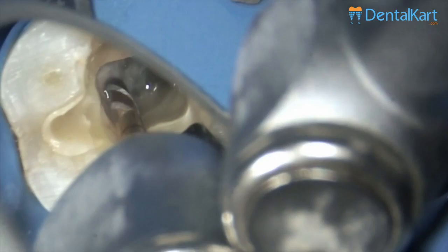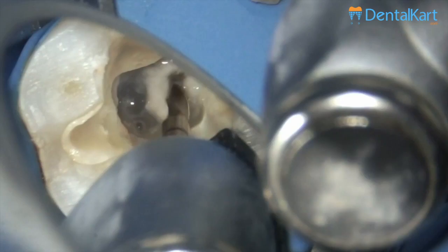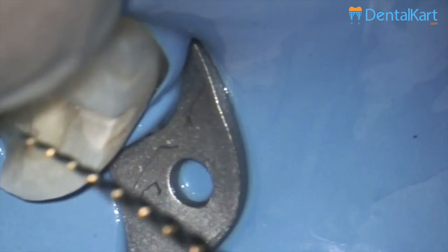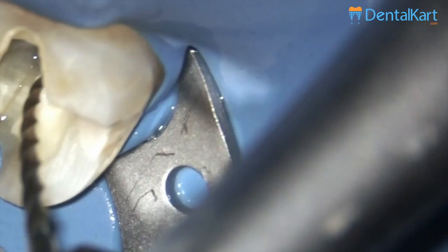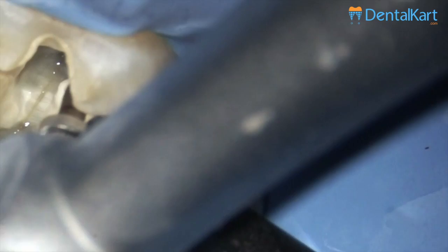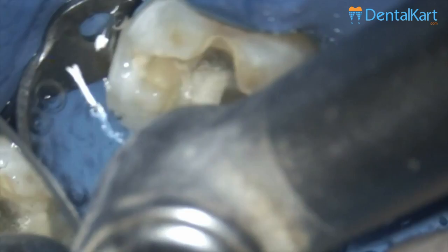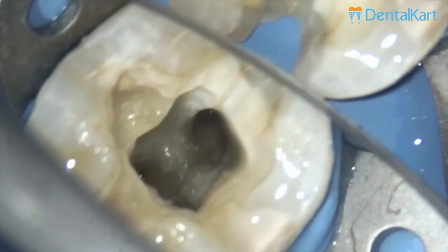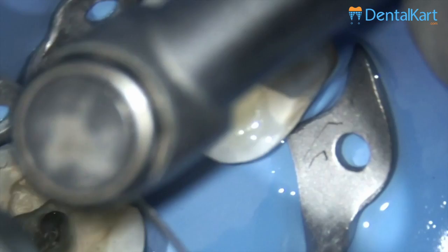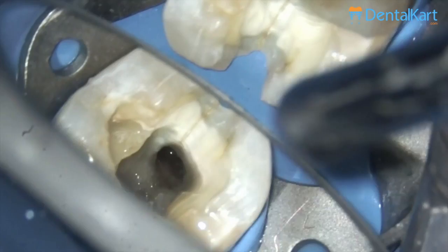The file has a pretty good cutting efficiency, going to a triangular cross section, and it is pretty easy to reach the working length. Now I am going to instrument one of the most difficult to access canals — the mesio buccal — when working on the right lower quadrant. You can see I pre-bent the file to easily place it into the canal. After shaping the main canals we always confirm if there are any extra canals. Upon slight de-roofing, you can see there is an additional distal canal which will also be enlarged in the same manner, starting with an orifice shaper and finishing with a 20/06.